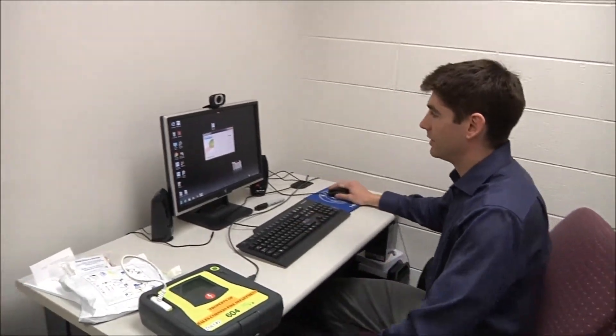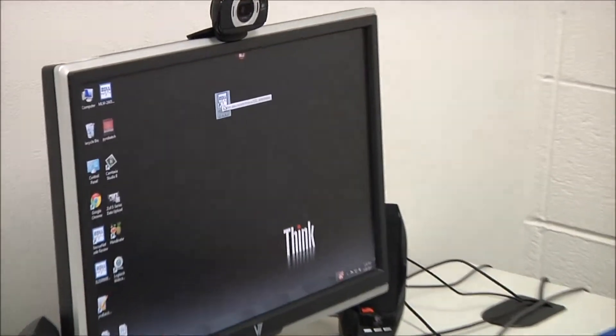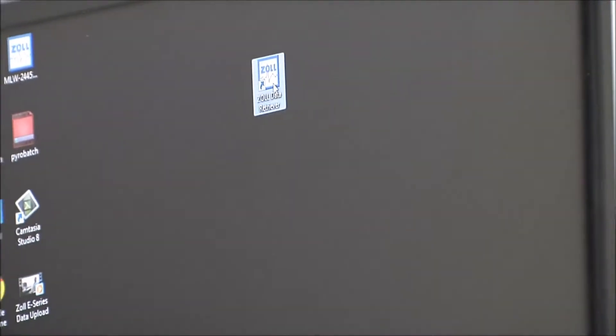So the first thing I'm going to do is open up Zoll Data Retriever, which is your icon right here on your desktop.